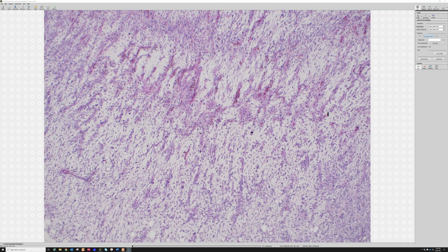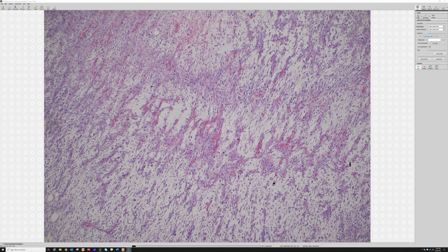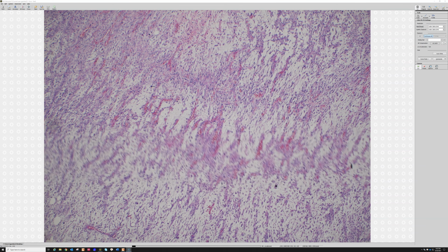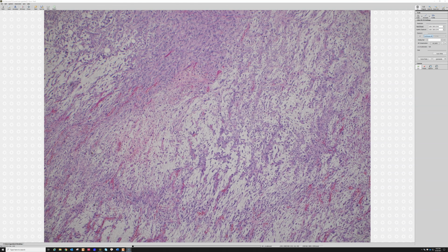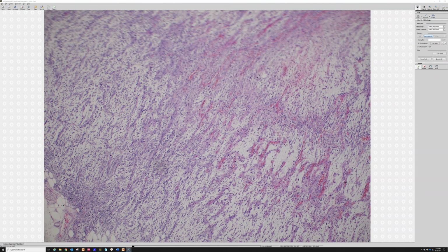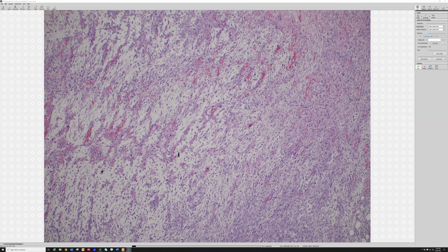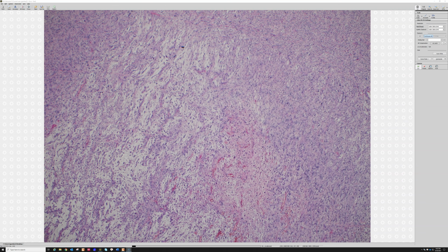And I've mentioned before in other videos, but the vascular patterns of soft tissue tumors I find to be relatively subtle, and it was one of the last things for me to really grasp as I finished up my fellowship. Even as I entered practice, I was still learning the nuances of recognizing vascular patterns. So if you have trouble recognizing all these curvilinear and hairpin and chicken wire and staghorn, all the different vascular patterns people talk about, don't feel bad. Some of that stuff is quite subtle, and it took me a while to pick up on it. So you're not alone if you struggle with that. But over time, those vascular patterns, if you can pick up on them, do become quite helpful.